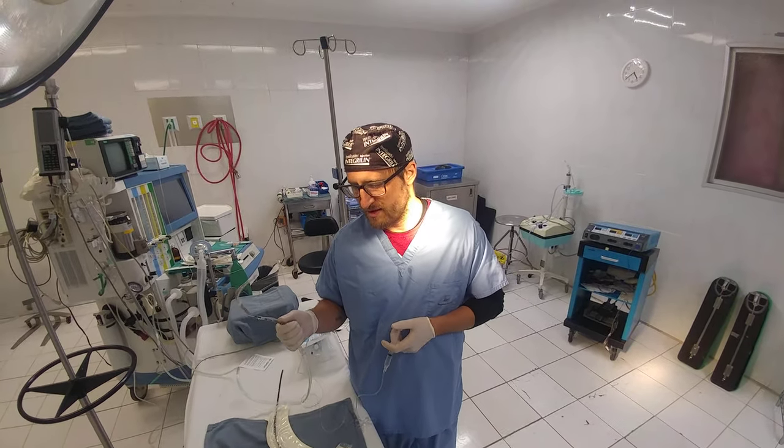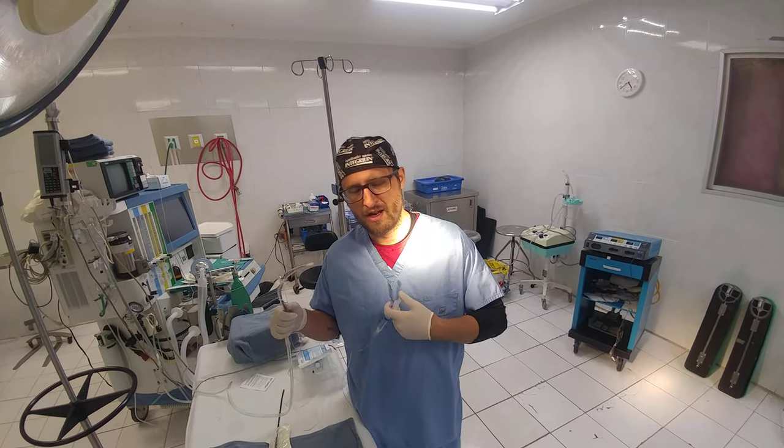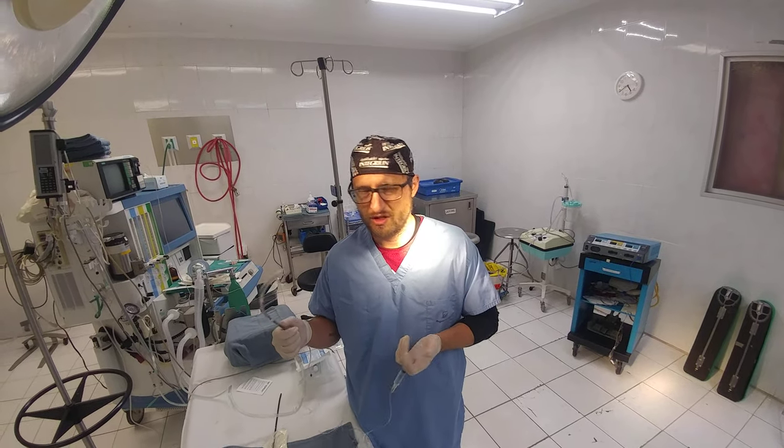This isn't the funnest, but it's not too bad. It's only an irritation from the stuff sometimes when you're spraying it, especially if you try to time with inhalations — it's going down the trachea, which is what you want anyways.